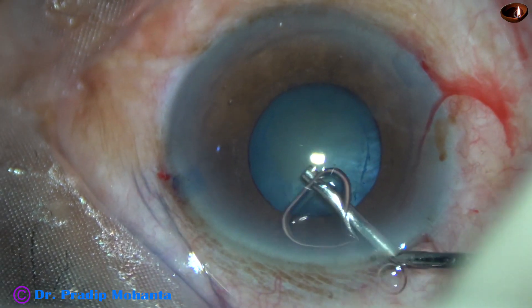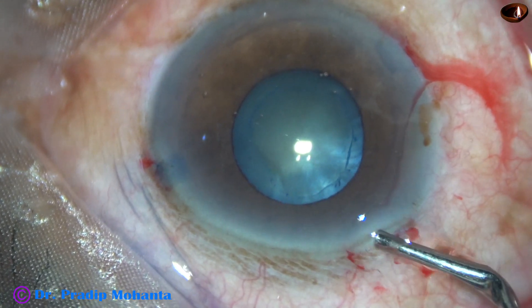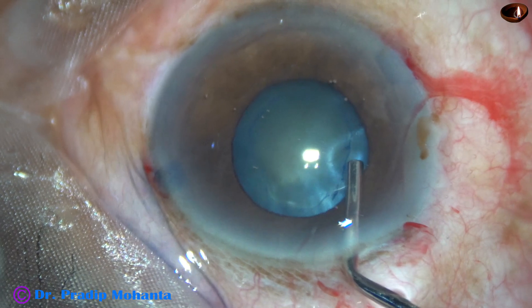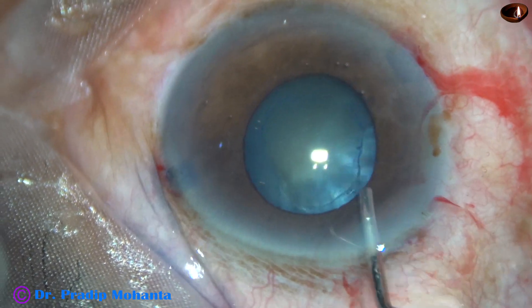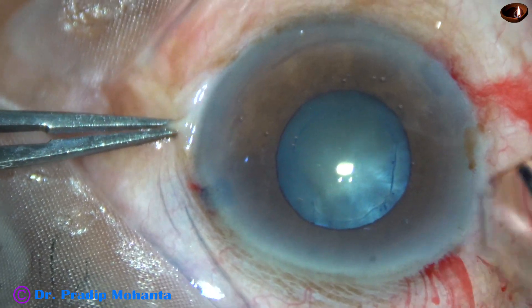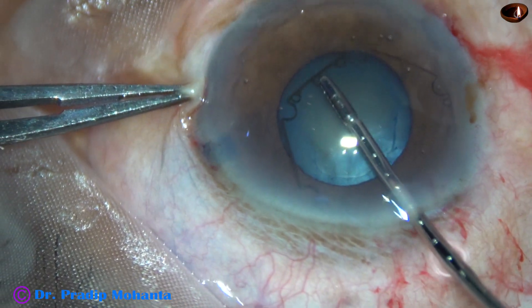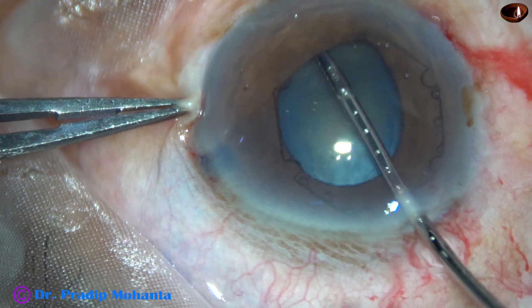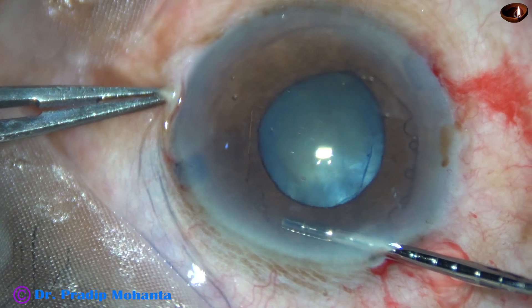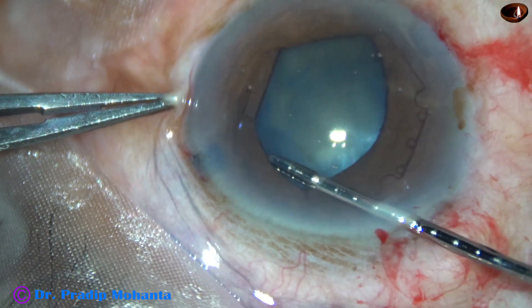Alternate flanges are tucked under the iris. In this way, we make some room under the iris, injecting a bit of visco. This is the Bhex pupil expander invented by Dr. Subhanvattacharji of Kolkata, India. The leading flange is tucked, and the flange at 1 o'clock is also tucked on-go through the main incision.